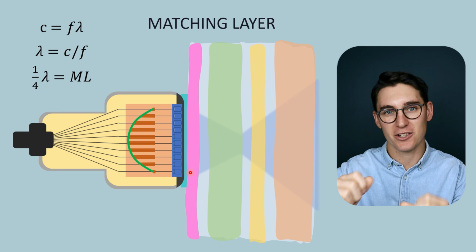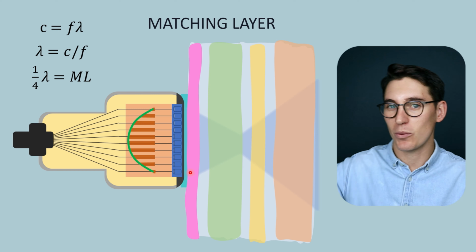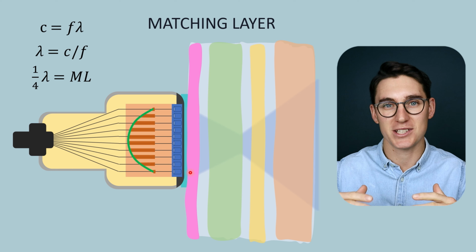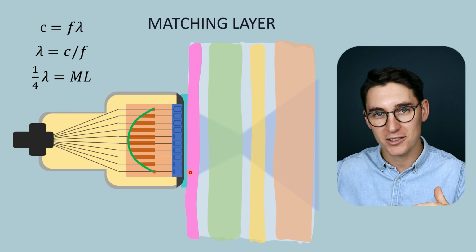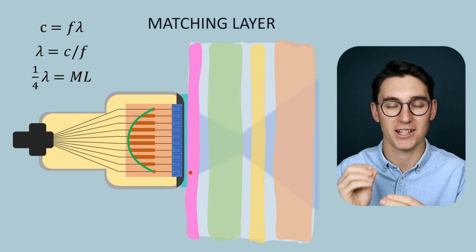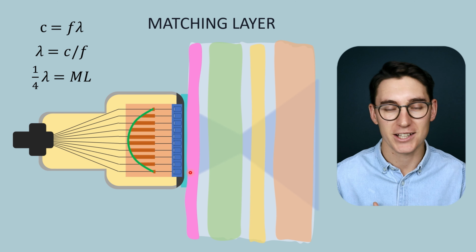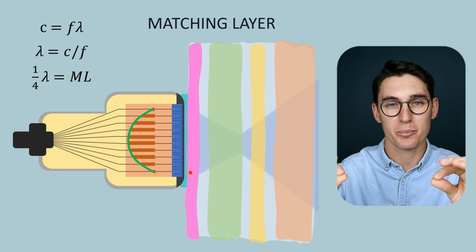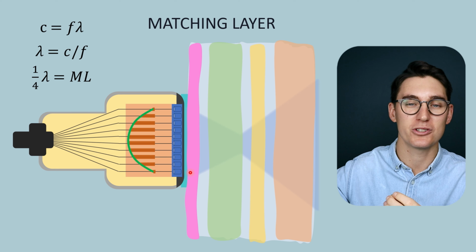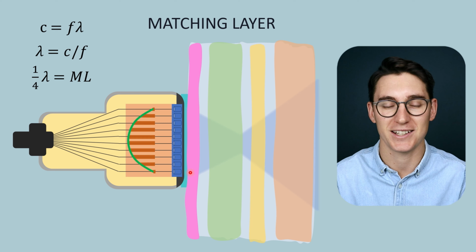Now, our piezoelectric material has been hit by a current and caused it to resonate at a set frequency. Now, when you hit a cymbal or when you strum a guitar string, it will resonate at that frequency for a long period of time until ultimately it comes to rest. Now, we want to create short pulses of sound in our pulse echo ultrasonography. So what we want to do is hit that guitar string and then stop it, or hit the cymbal and then stop the cymbal. We want to create periods of time where we can listen or receive those returning echoes. Now, that is the function of the damping block, which we're going to look at in our next talk.